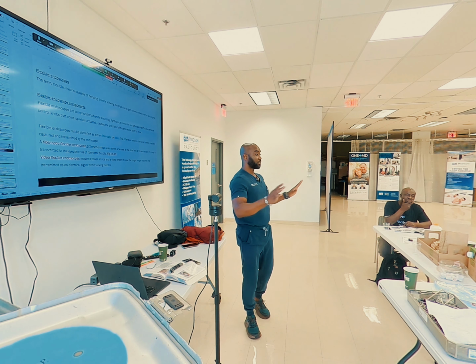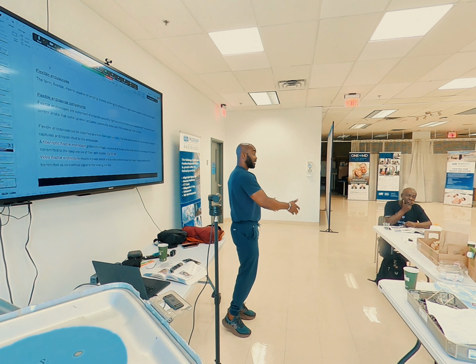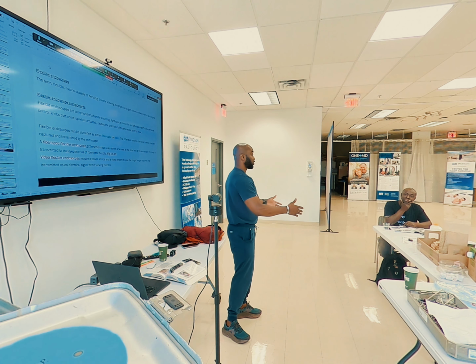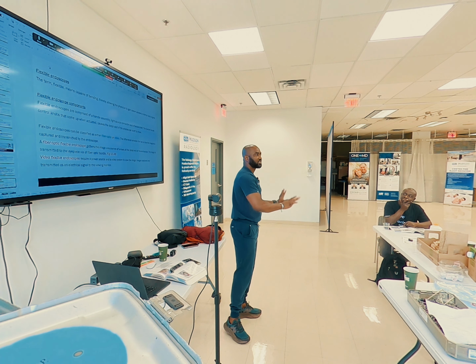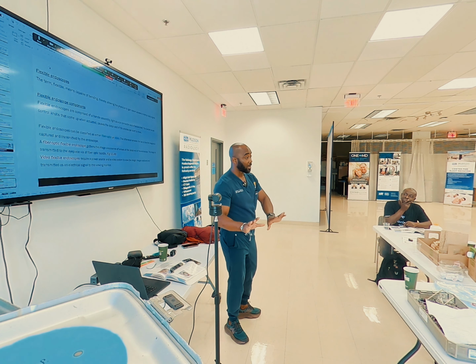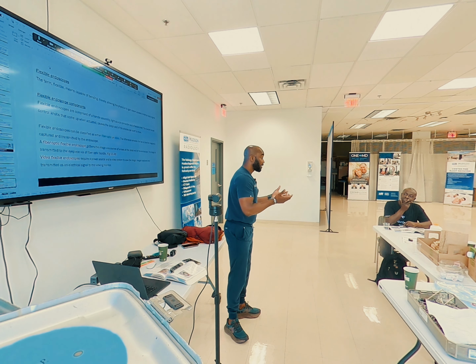When instruments are already clean, you have to determine whether this instrument is going to be disinfected or sterilized. With semi-critical instruments, some can be sterilized and some can be disinfected, but we're talking about the minimum requirement. And the minimum requirement for a semi-critical item is high-level disinfection.